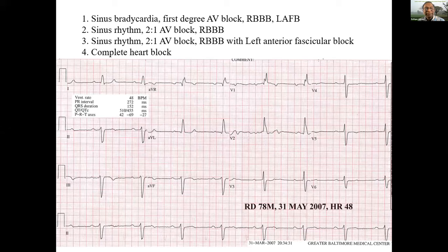Anybody else? Dr. Havish, what about V1? Because V1, this is the problem, right? Because in the V1, that first one looks like this. I don't know, this is immediate. But in the rhythm lead, I don't see that. So that's why I committed to lead two. Because I don't see a good similar P wave coming repeatedly. But yes, and I just answered to one of the attendees saying that what about this small thing that we see sometimes? And I told him that I always face that problem also. Yeah, but I don't know. Yeah. So I'll comment on this.